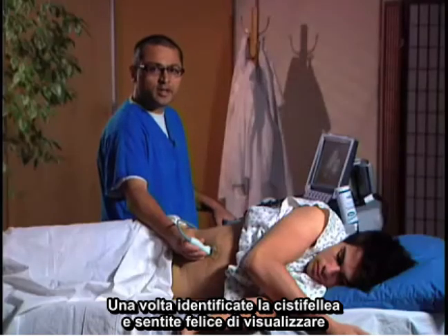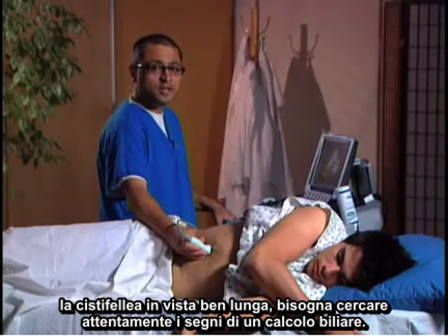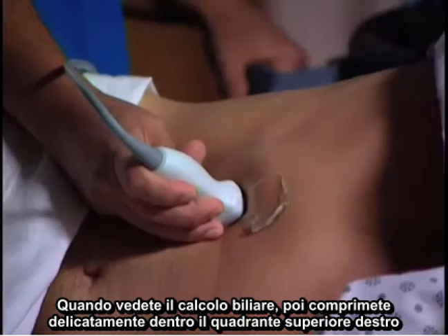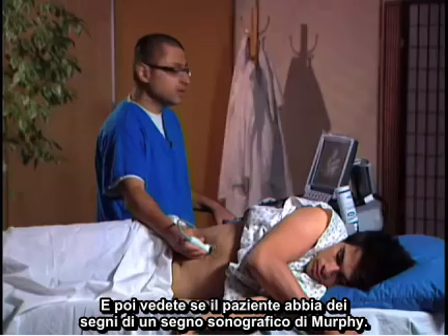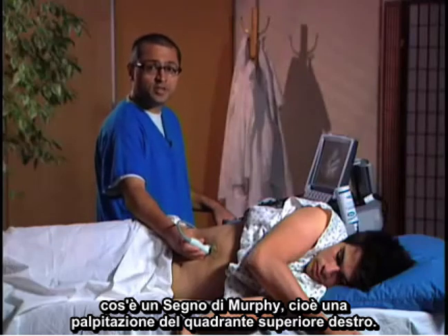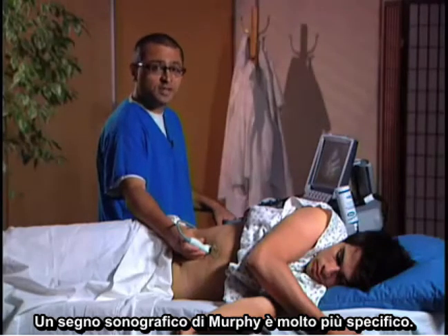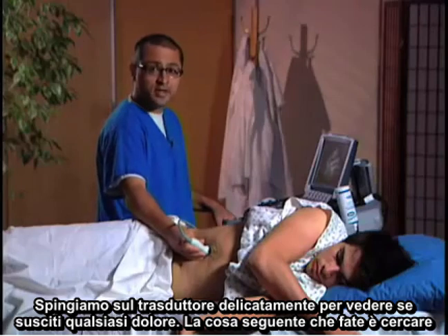Once you've identified the gallbladder and you're happy you can see it in a nice long view, you have to carefully look for signs of a gallstone. Once you see the gallstone, you're going to press gently into the right upper quadrant and see if they have signs of a sonographic Murphy. A sonographic Murphy is much more specific than the clinical Murphy sign — we press on the transducer gently to see if that elicits pain.